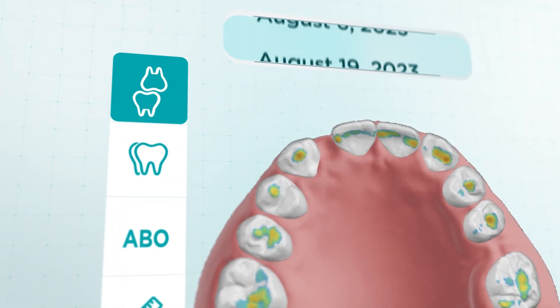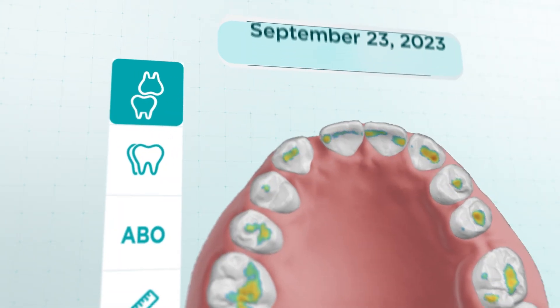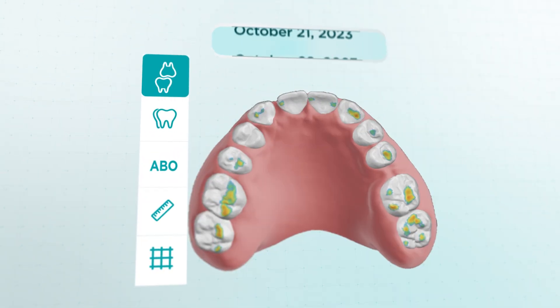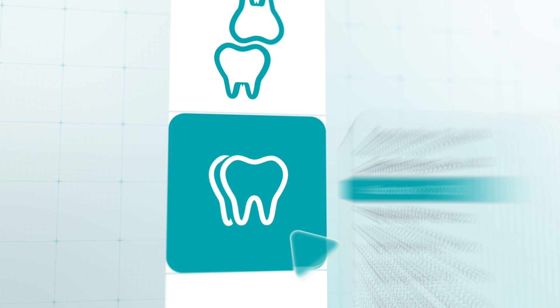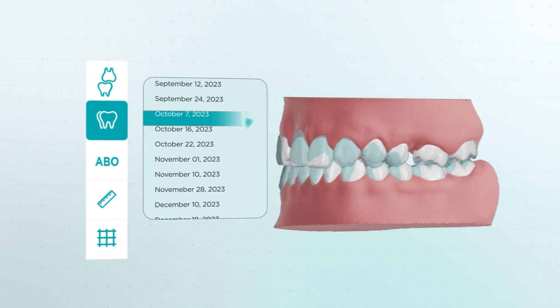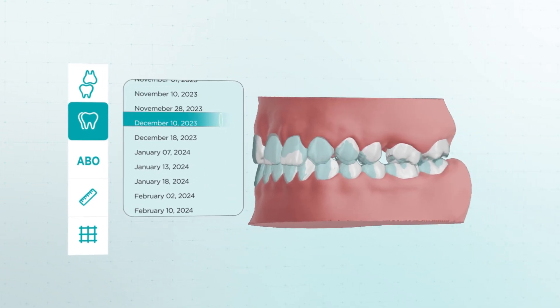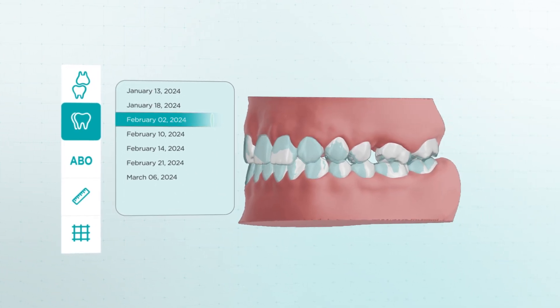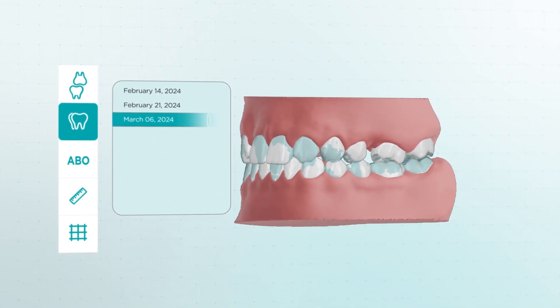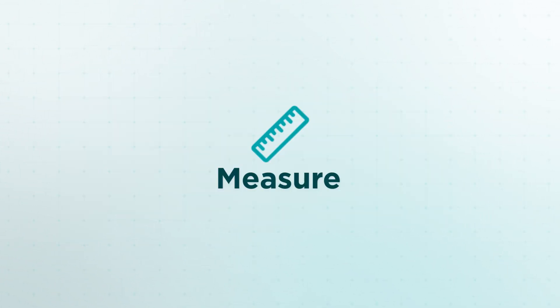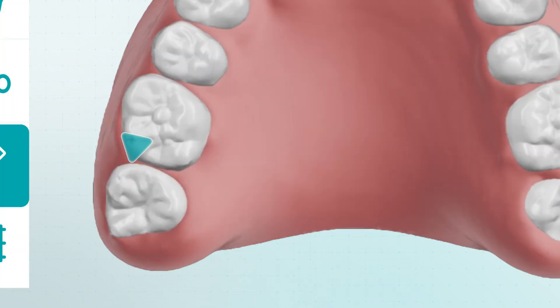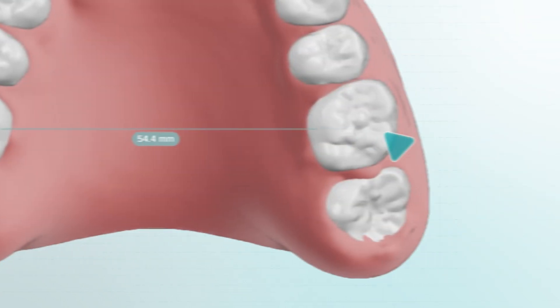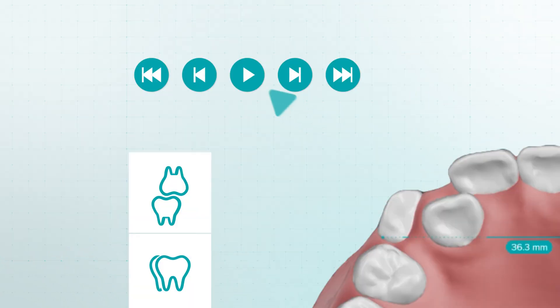Review the actual progress of the treatment plan, knowing each 3D model is generated from current, real photos. And utilize advanced tools to ensure everything is proceeding as expected.